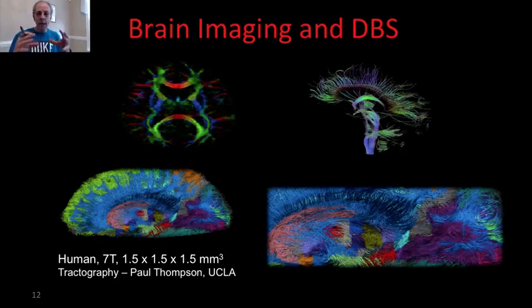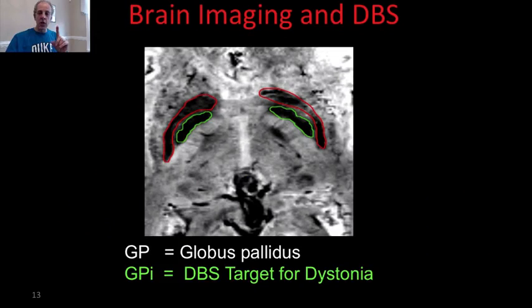And then when you have all that, which is already one of the image processing challenges, you start doing other image processing things, like, for example, image segmentation. You might be able to automatically or semi-automatically, for example, using active contours, segment and mark the regions that the neurosurgeon knows are the target regions. So you develop active contours that are specialized to these types of challenges.